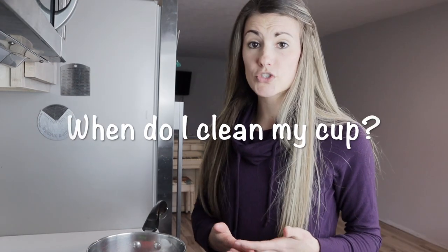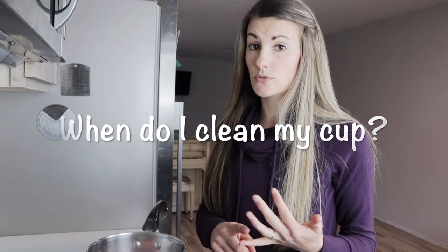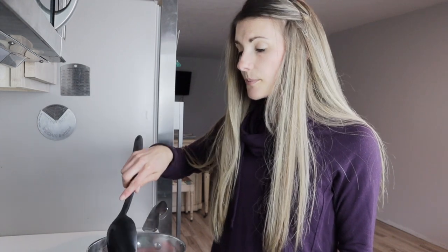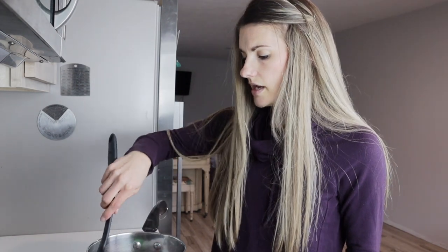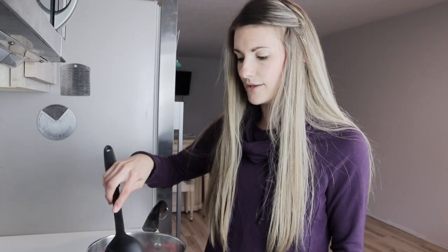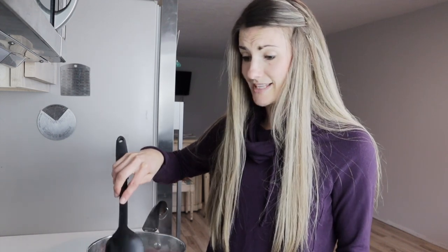If you're wondering when you should clean your cup: first, you definitely want to clean it the first time that you get it. You have no idea who has touched it in the making of the product, so definitely boil or sterilize it before that first use. Some products recommend that you boil it at the end of each cycle or the beginning of the next cycle. And then there are other companies that say you don't even need to do that — you can just wash it with soap and water in between cycles, and that's good enough.